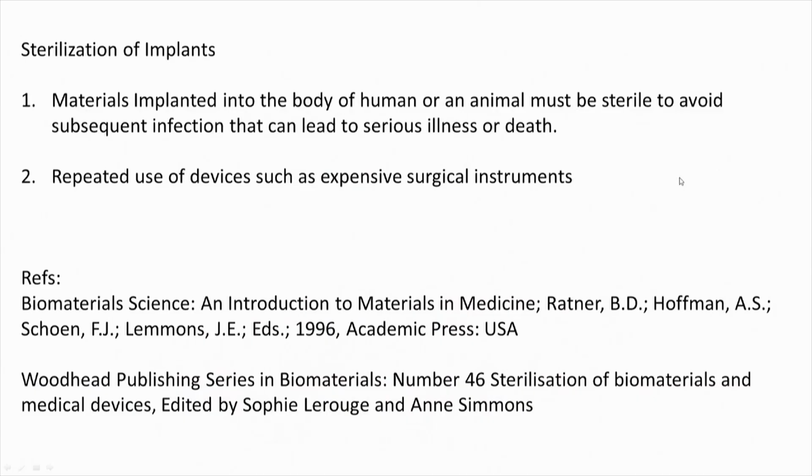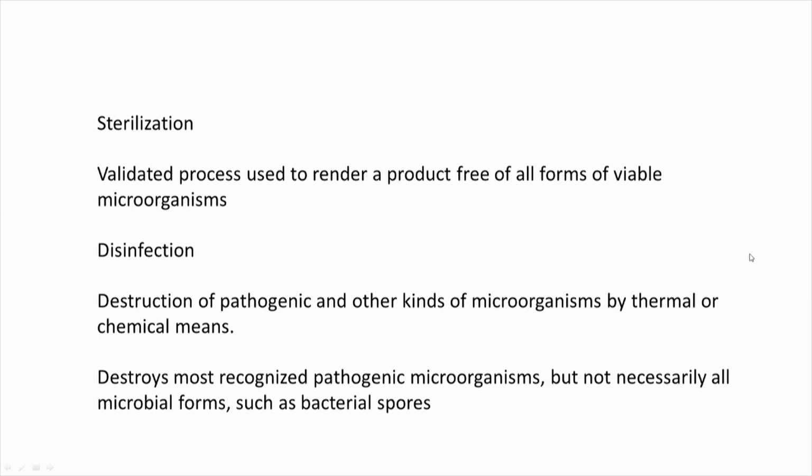These two are good references to have a look at if you are looking at materials in medicine and issues related to sterilization. We need to have a validated process, because every time we cannot use an ad hoc sterilization procedure. It has to be repeatable, and it should render a product free of all forms of viable microorganism. So, sterilization has to be a validated process.